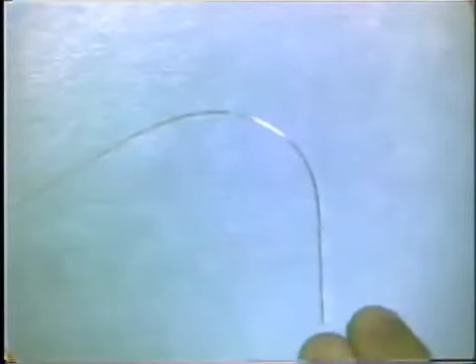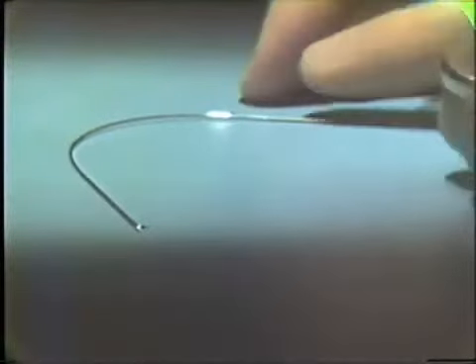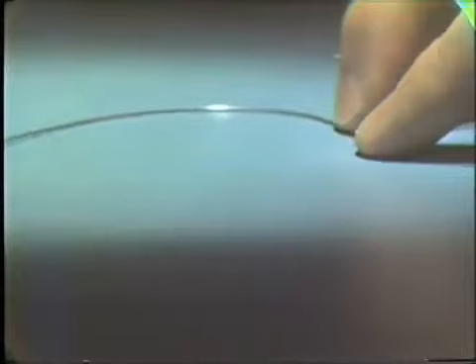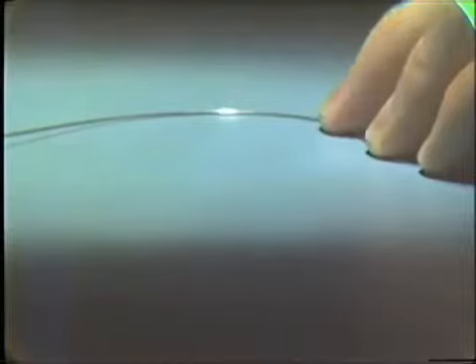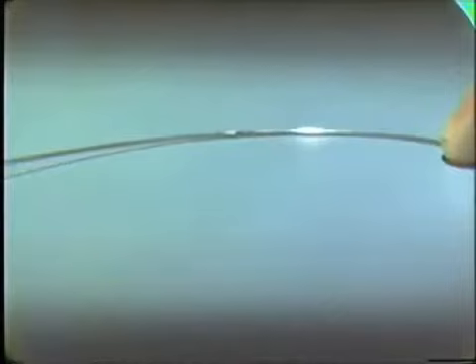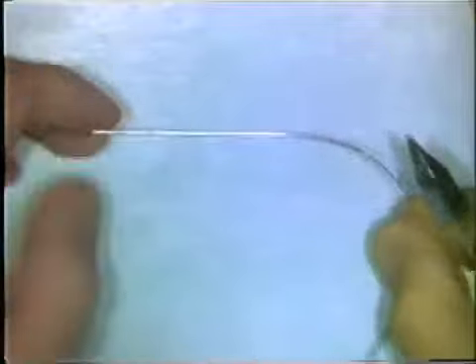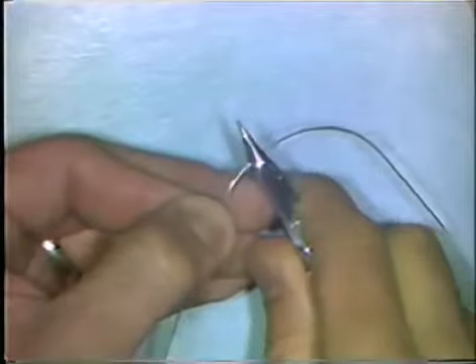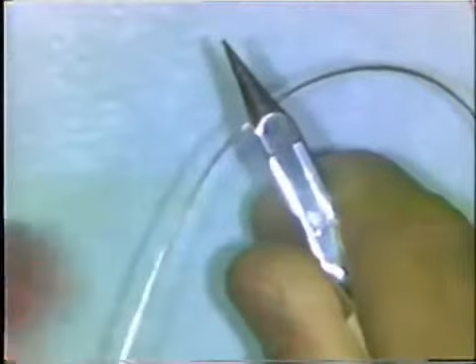Now, you do that by placing the curve on the table surface, glass slab or formica surface, and hold down one end of the wire with your hand and observe the spot where it begins to leave the flat surface, right in here. You mark that spot with the wire marking pencil and place the wire in the beaks of the plier, the flat base portion, and make a small downward adjustment bend.